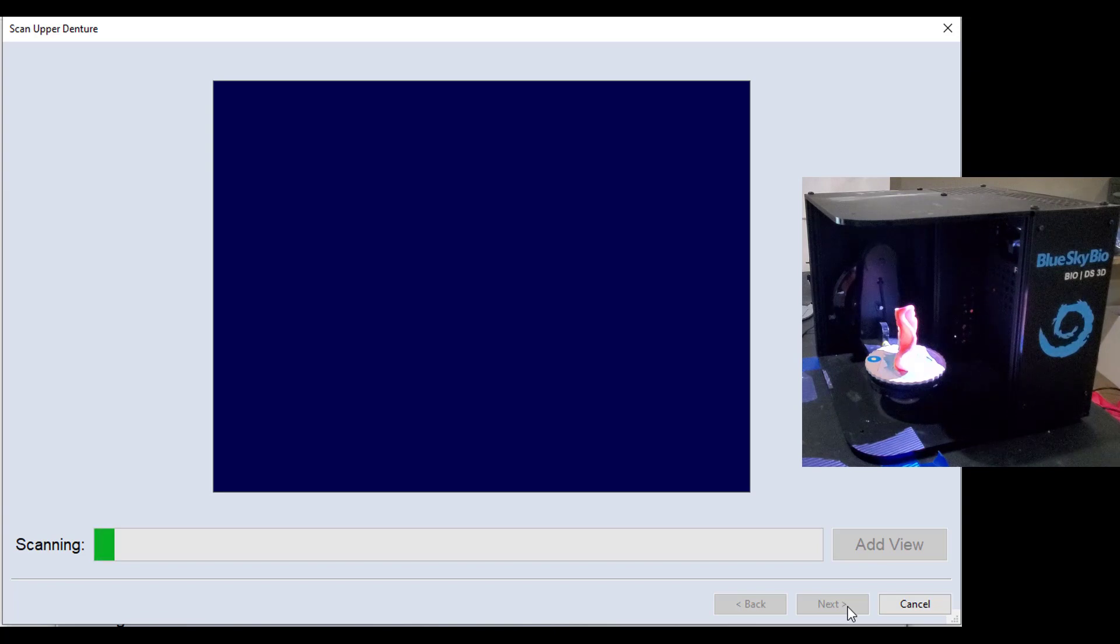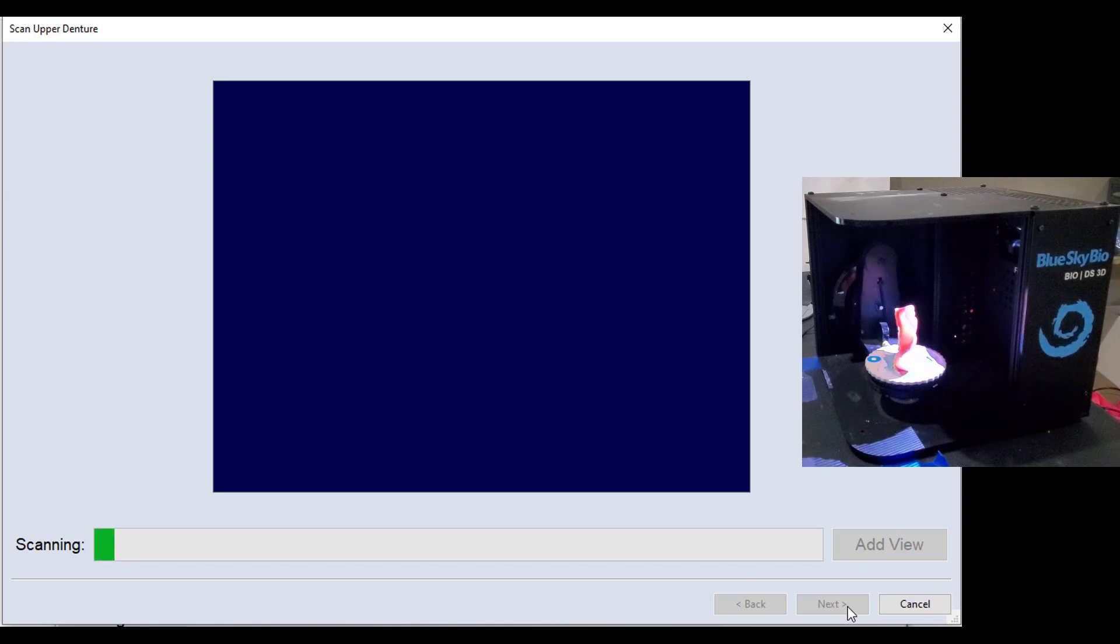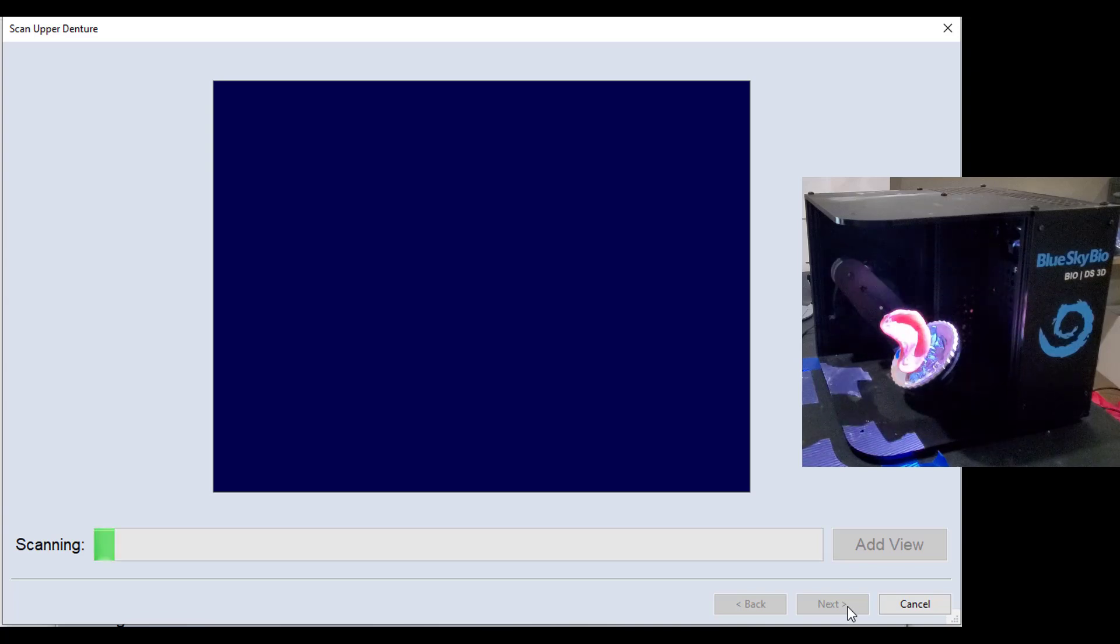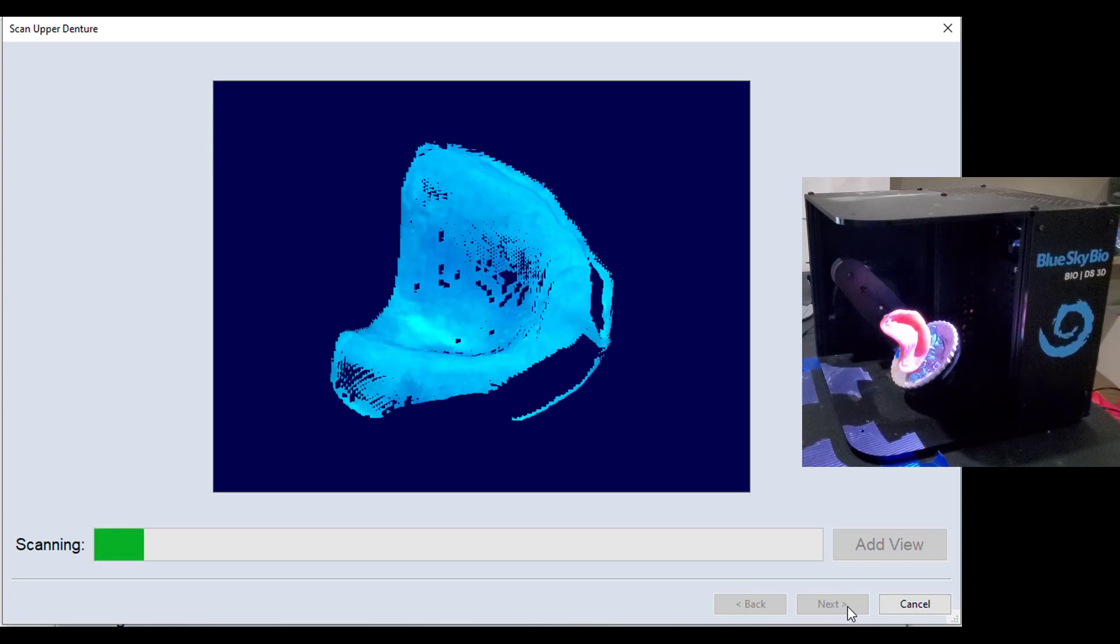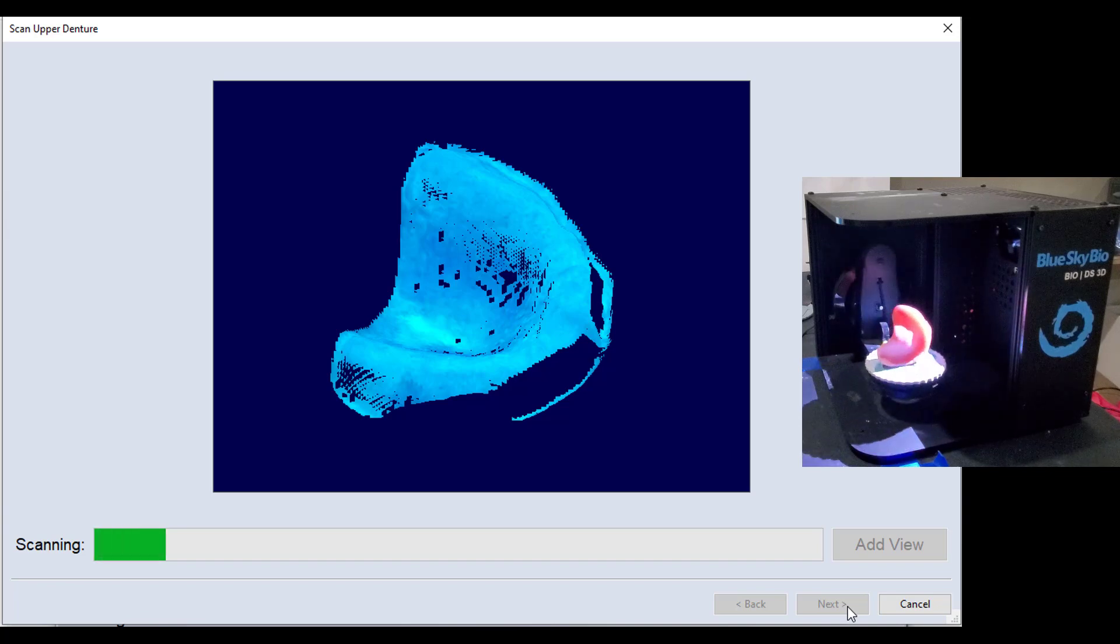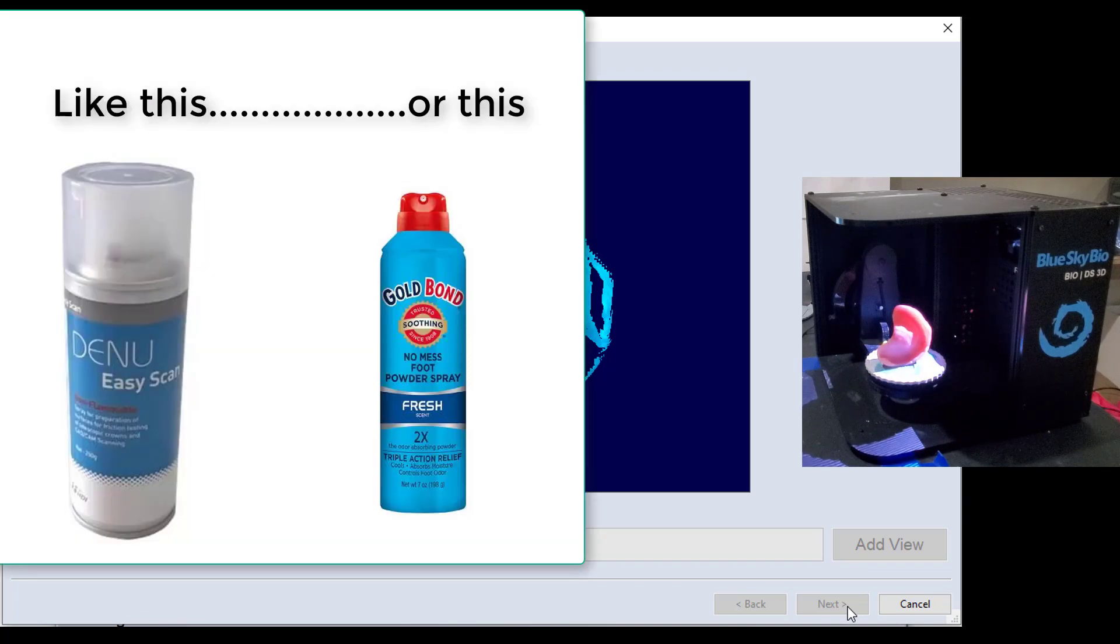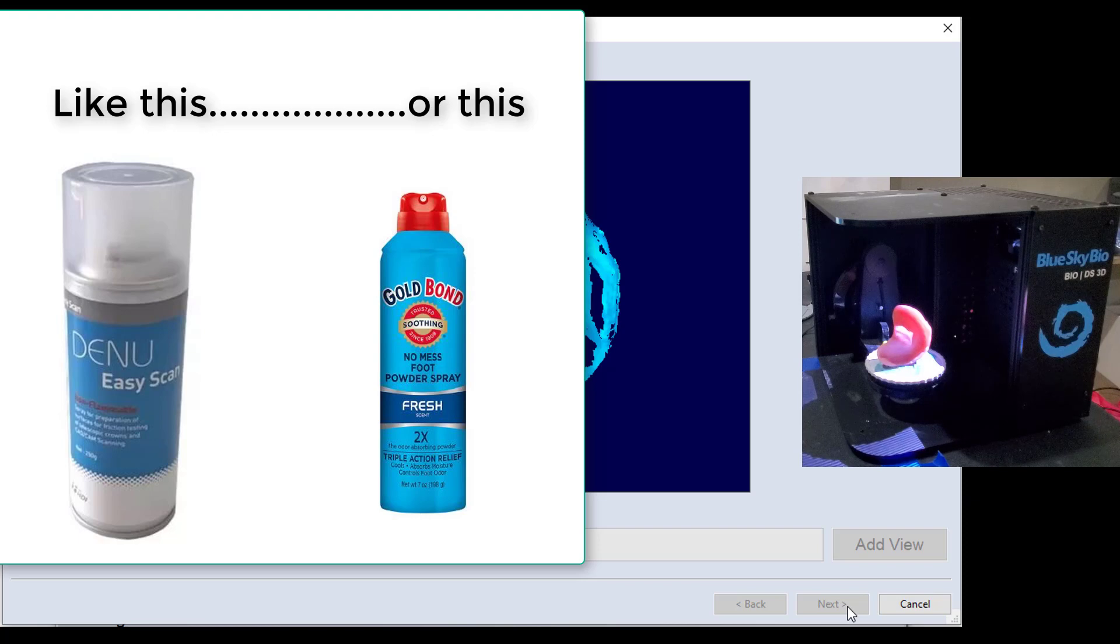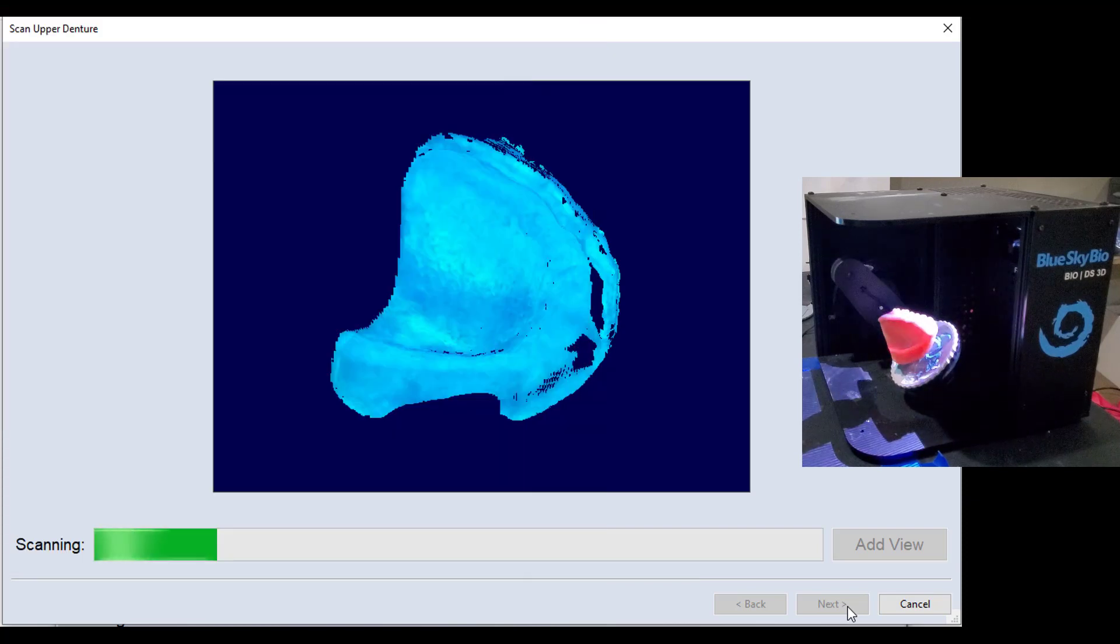But most dentures are going to be highly polished, and they're going to be very reflective, and so you probably should expect any time that you're duplicating a denture, if it's got any level of polish on it, you're probably going to need to hit that with some type of a scanning powder. It doesn't have to be anything fancy, but you're going to have to do something to knock the shine off that so that it will image with the best quality.